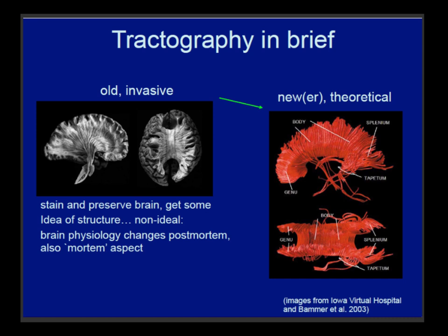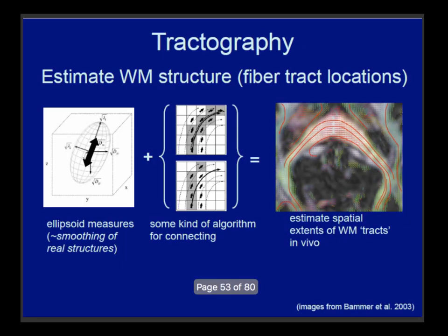So what we want to try to do is reconstruct as much as possible structural information that's non-local using quantitative, computational measures. Basically, at every location in the brain, voxel by voxel, we have these measures of these ellipsoids. Where they're pointy means we think there's structure there, so we can record where they're oriented in space and store them in this grid.